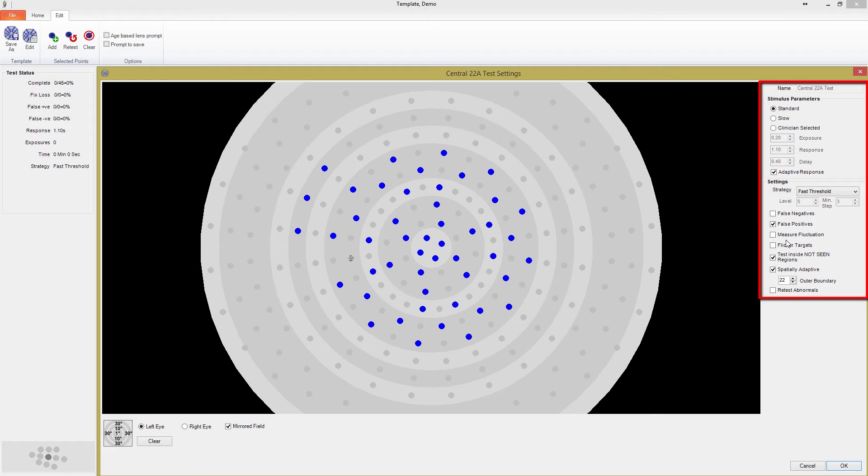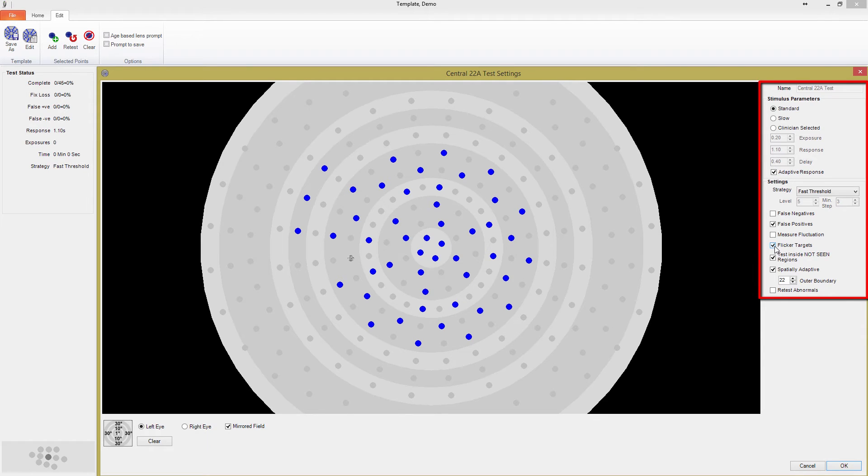A special feature included with the M700 is the ability to design any test with flickering stimulus. Selecting this option enables a test in which the patient is required to respond to the stimulus only if they perceive the target to be flickering. Please read the section on Flicker Perimetry in the M700 user manual or watch the additional template tutorial to learn more about how this works.